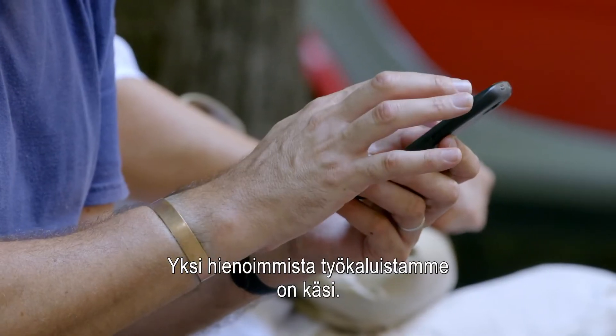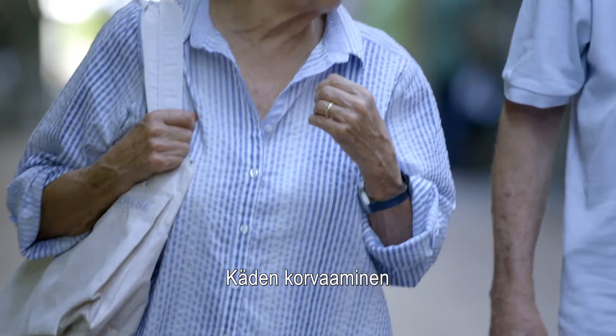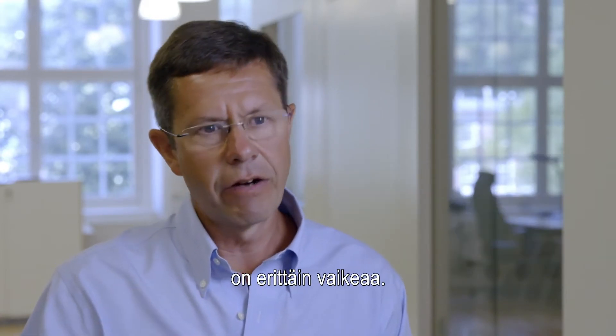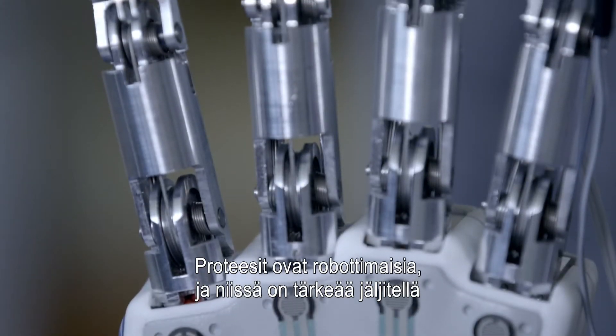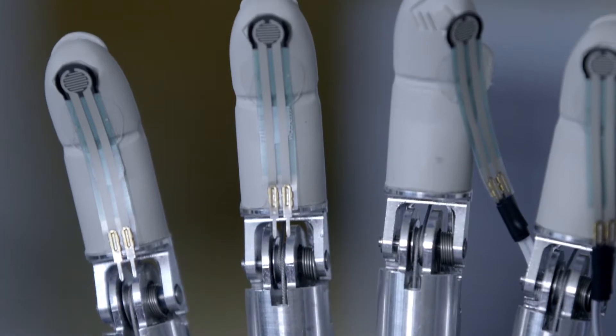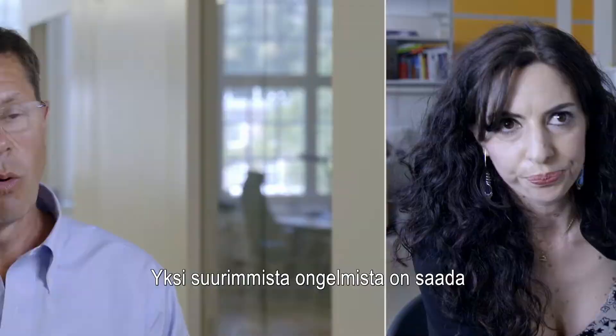One of the most fantastic tools that we have is the hand. To be able to replace a hand or restore some of that functionality is a very, very difficult task. The prosthesis is a robot, and it is essential to replicate on the prosthesis the same behaviour observed in a normal human.